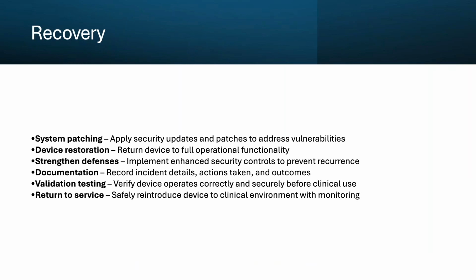Next is device restoration, where we systematically return each device to full operational functionality through firmware updates, configuration restoration, and ensuring all clinical features work as intended. Patient safety depends on complete functionality. A partially restored device could be more dangerous than no device at all.